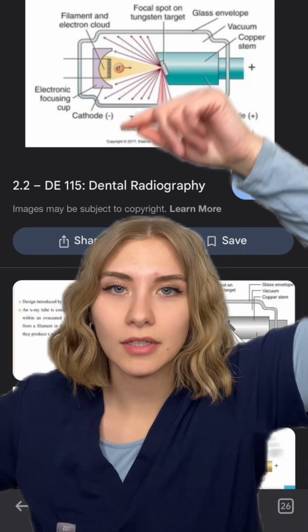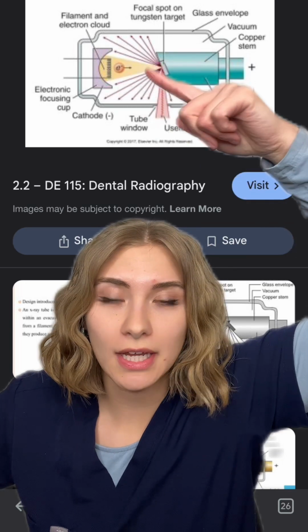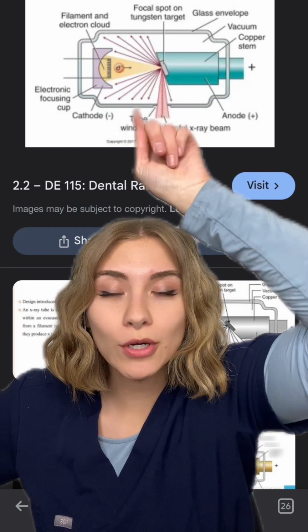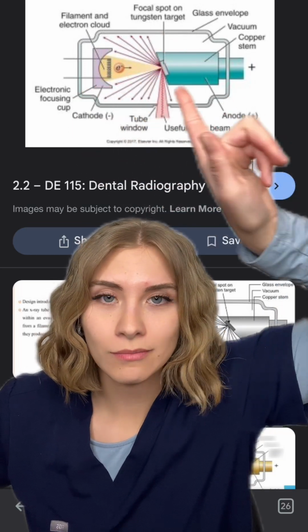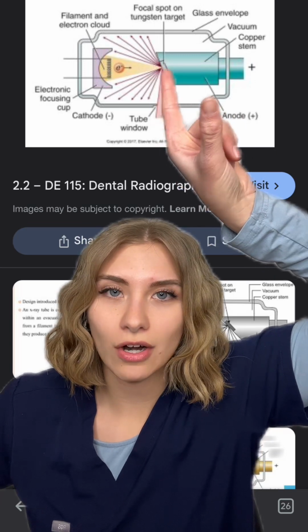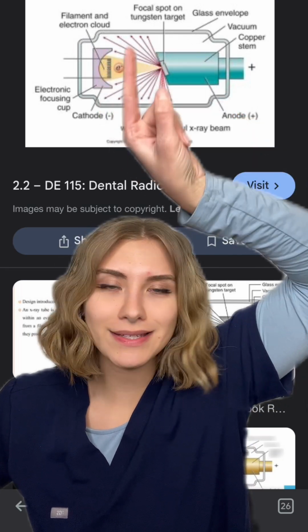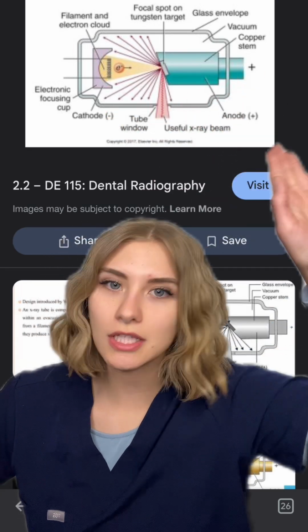So quick review, the cathode has these tungsten filaments. They get super hot and they create negative electrons. They're constantly going when it's on, which is from the step down transformer. Then when the button is pushed, the negative electron cloud goes to the tungsten target, where the anode is, and it creates the radiation because the tungsten target converts the electrons to energy to create the radiation. And the step up transformer helps bring these negative electrons to the tungsten target. But that's also called kilovoltage, which we'll talk about later. Kilovoltage is the quality of X-ray.